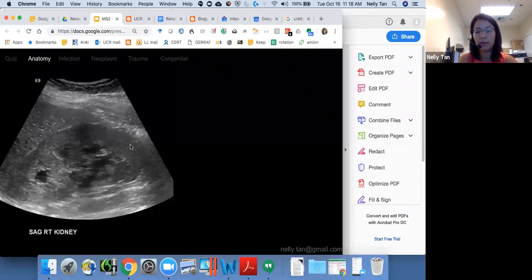Here we have the renal pelvis, and with ultrasound we use the word echogenicity because that's what we're evaluating. Ultrasound was developed by the Navy, where they emitted sound waves and then listened for the reverberation. Sonar, exactly. And that creates an image. So ultrasound is really great in general for the renal collecting system, anywhere you have a nice window. It was designed for water, so you need some kind of interface. If there's air, then it makes ultrasound useless, although it can be advantageous at times.